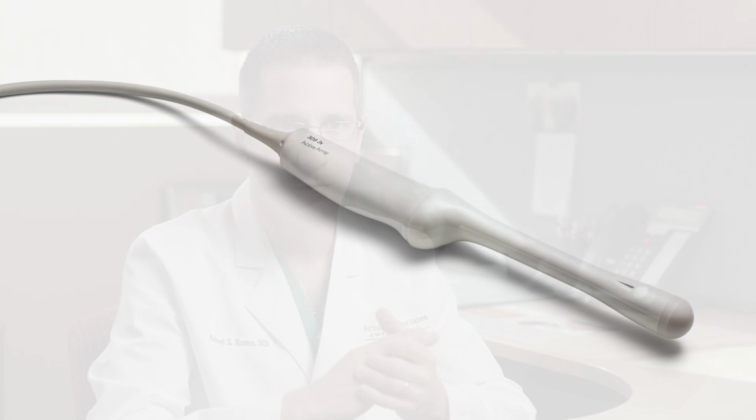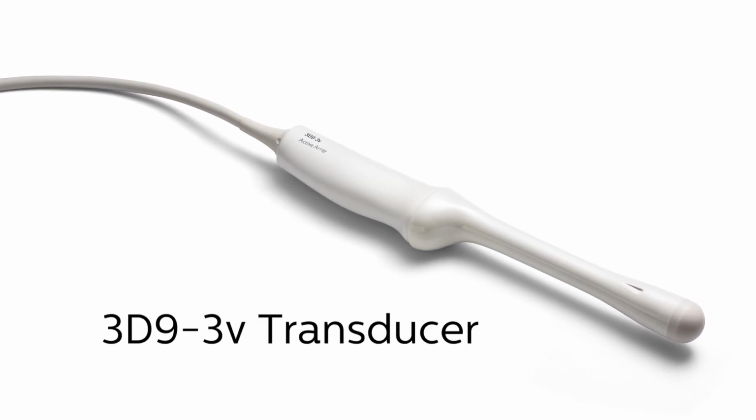3D9-3V as a transvaginal transducer is an excellent transducer. It provides incredible imaging quality. This software release incorporates the capacity to use the tilt feature. It allows us to actually steer the imaging without having to manipulate the actual transducer.